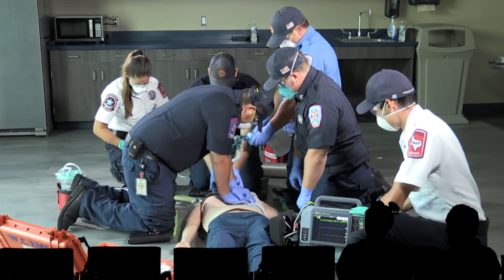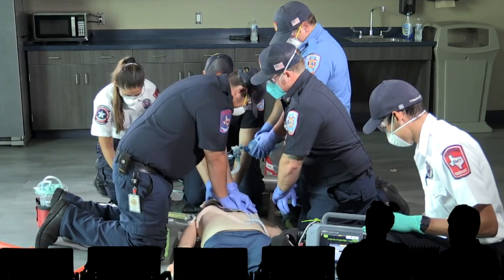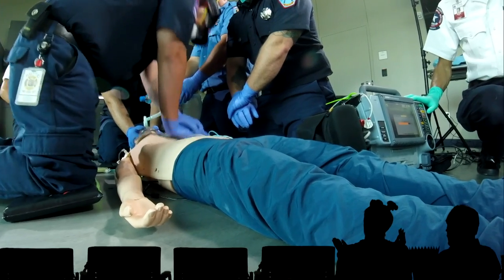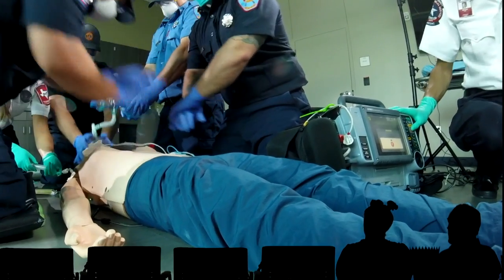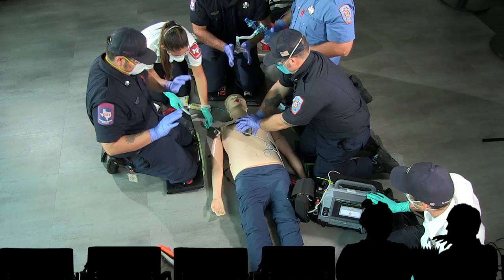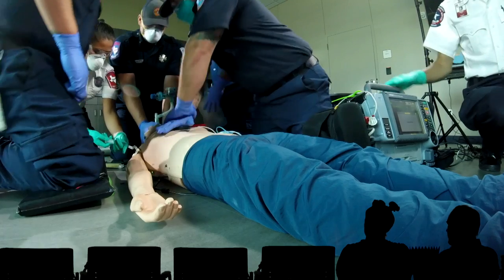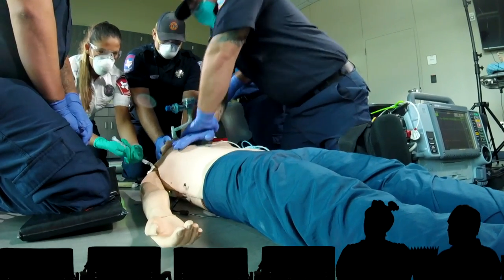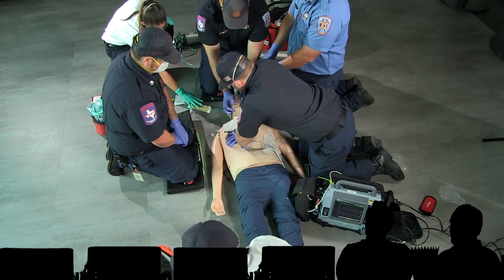Oh my gosh, yes. How could I miss that? That is some sexy bagging right there. Two-handed seal — is that a normal two-handed seal and they can do tricks? Or like seal barking? He's lifting the mandible up into his two-handed seal. I love it.